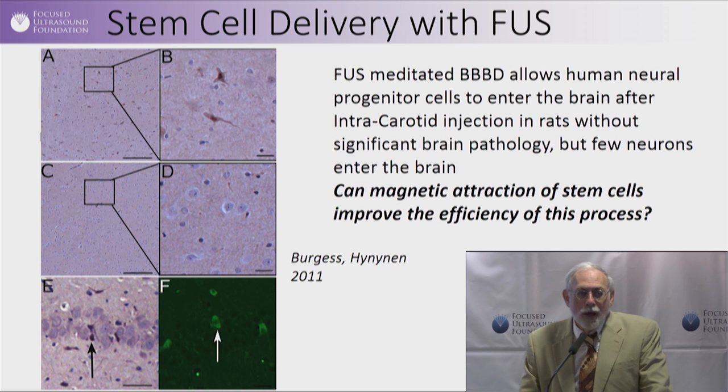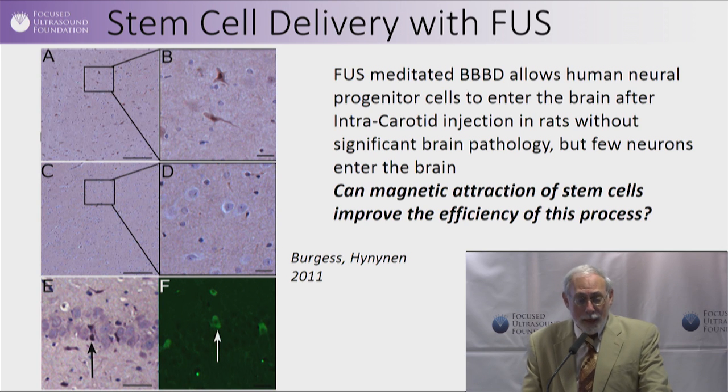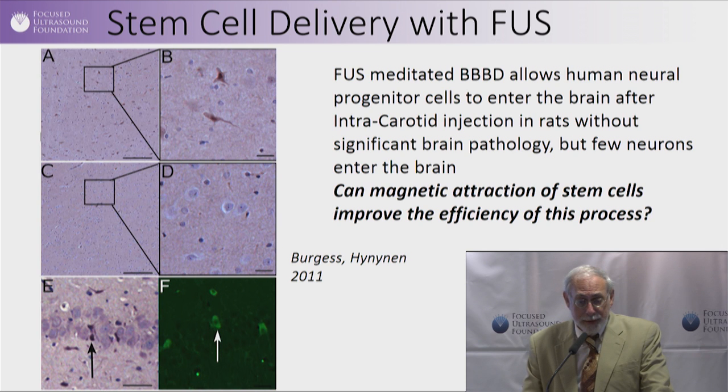Well, the biggest of all of the therapies are actually cells. And the work of the Toronto group demonstrated several years ago that even these very large therapies can be introduced into the brain with focused ultrasound if you open the blood-brain barrier safely. Like all therapies put into the blood, part of the issue is getting enough in to be clinically effective. And so at the University of Maryland, we've taken a complementary technology that's also minimally invasive, called magnetic targeting, to try to improve that delivery.